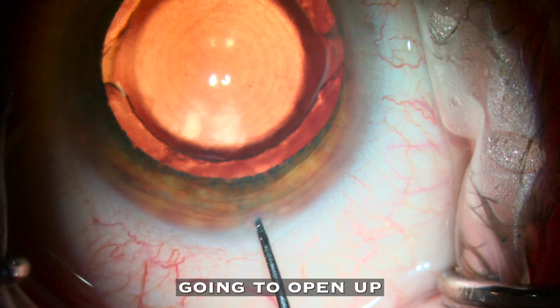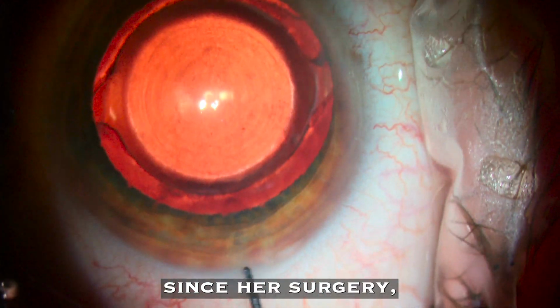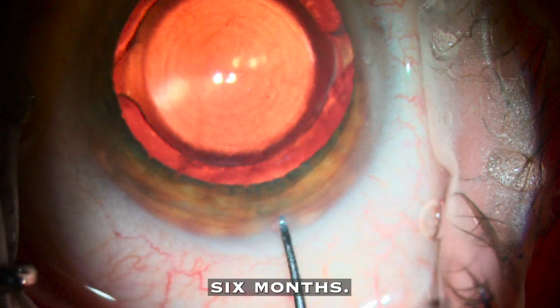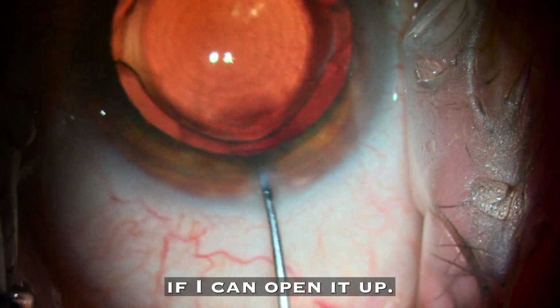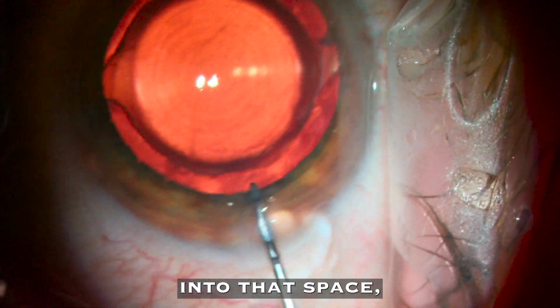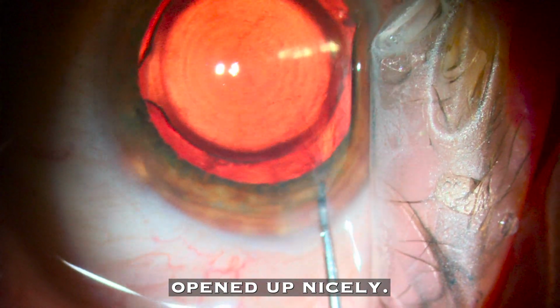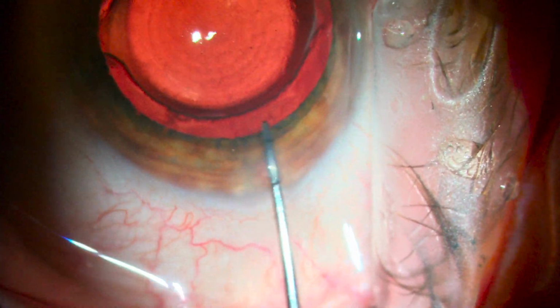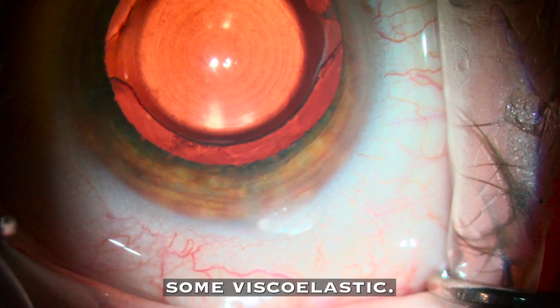First step, I'm going to open up the old cataract wound. It's been about 6 or 7 months since her surgery. Usually around 6 months, I don't try this. I just make a new wound, but I thought, hey, let's see if I can open it up. So I'm taking the Donnenfeld spatula and just easing my way into that space, moving it back and forth. And it actually opened up nicely, no issues here. I didn't show it, but I also made a paracentesis wound, 2 of them, and injected some viscoelastic.